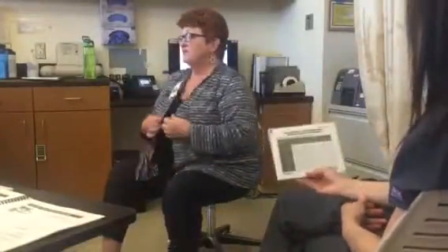And I would suggest that you just get in the habit when you're running CMNC to do, it takes all of 5 seconds to know the white count and the inlet pump and do the little connecting intersection and decide on the get-go. And then change it immediately, right? Because if you have a buffy coat to support that higher collect pump flow rate, use it, right? It means higher yield if you're paying attention to this. If it's something you choose not to use, that is certainly your call too.